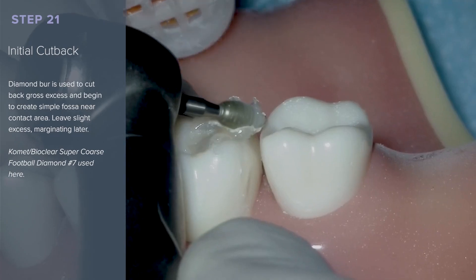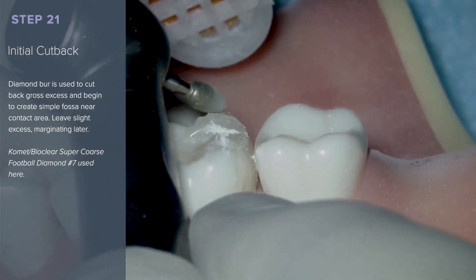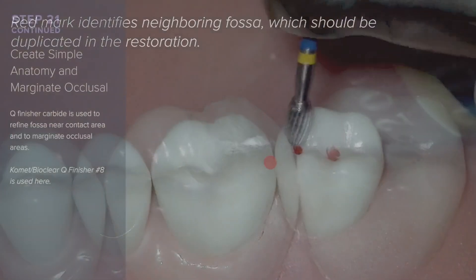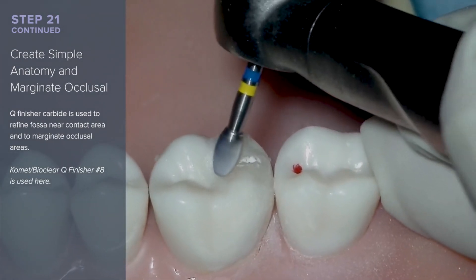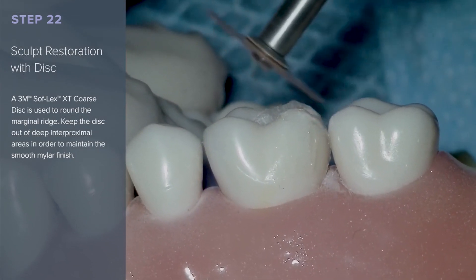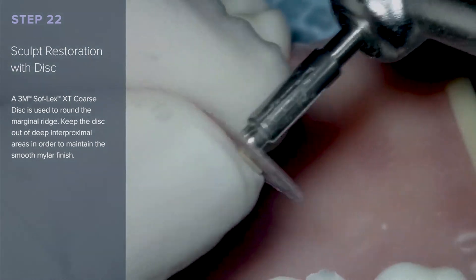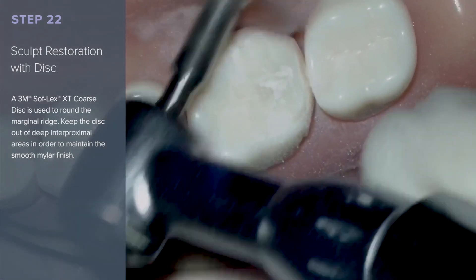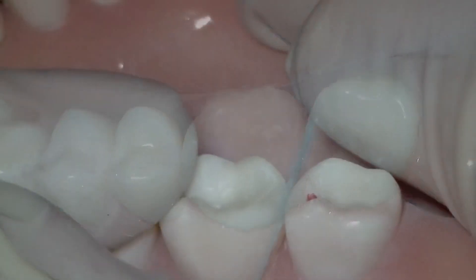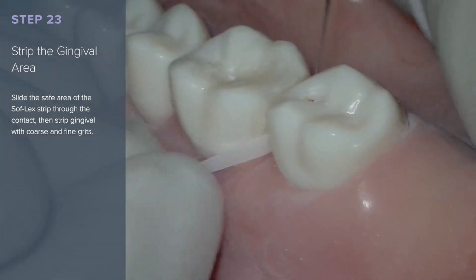For initial cutback, a football-shaped diamond burr or carbide is used to cut back gross excess and begin to create simple fossa near the contact area. Leave slight excess for marginating later. The QFinisher carbide is used to create simple anatomy and begin to marginate the occlusal surface. A 3M Sof-Lex XT coarse disc is used to round the marginal ridge — keep the disc out of the deep interproximal areas to maintain the smooth mylar finish. Placing the disc in the inverted position is often very helpful for sculpting. Slide the safe area of the Sof-Lex strip through the contact, then strip the gingival with coarse and fine grits.